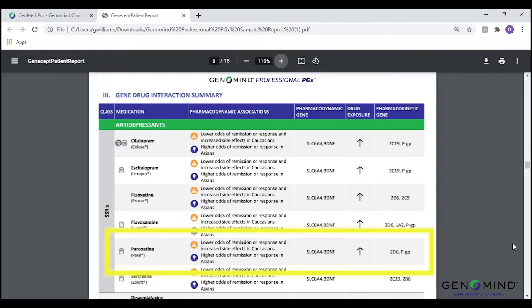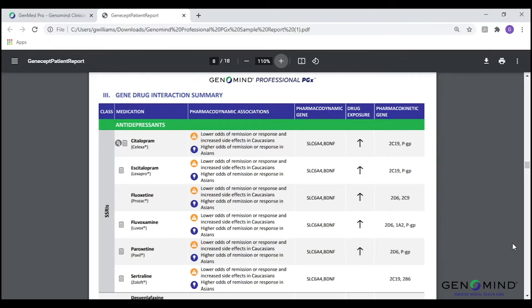Let's use paroxetine as an example for the interpretation of this page. As we can see highlighted in the pharmacodynamic associations column, paroxetine and the other SSRIs were associated with a lower odds of remission and response, as well as an increased risk of side effects in Caucasians. This information is based on the patient's SLC6A4 SS genotype. Now, if the patient was of Asian ethnicity, literature regarding the patient's BDNF Val/Met genotype shows an increased odds of response or remission with SSRI medications. Furthermore, if we look under the drug exposure column, we see an up arrow. This up arrow is in reference to the increased drug exposure to paroxetine that can be expected due to the patient's CYP2D6 poor metabolizer status, as well as the patient's variation at the ABCB1 gene. This increase in exposure may lead to the consideration of a dose adjustment or the utilization of an alternative therapy.